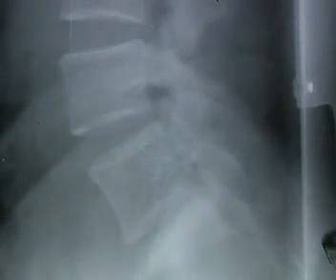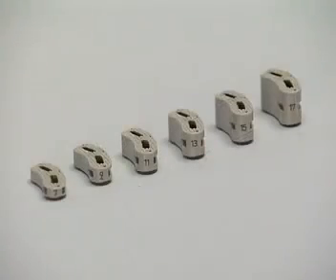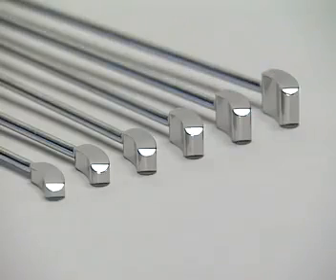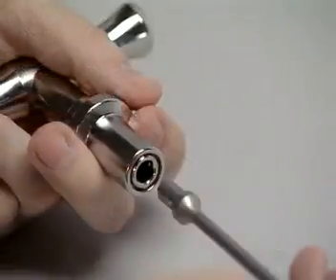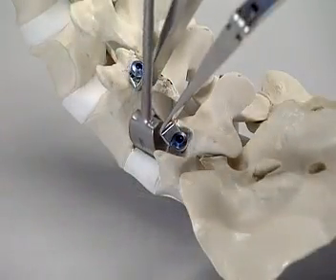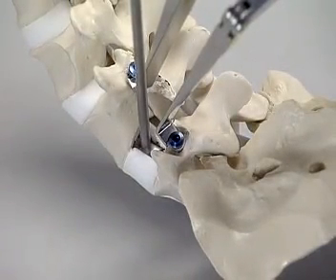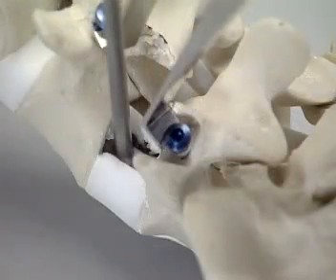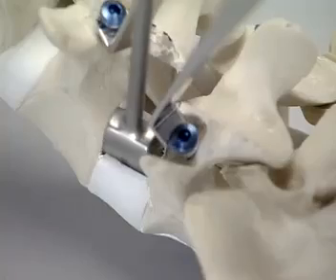Before surgery, the appropriate cage height is estimated by comparing the Travios radiographic template with the adjacent intervertebral discs on a lateral radiograph. The cage height is later confirmed by inserting the appropriate trial implant. The cage height ranges from 7 mm to 17 mm in 2 mm increments, and for each cage there is a corresponding trial implant. The trial implant is mounted on the T-handle by pulling back the sleeve. In this exercise, a 15 mm trial implant is inserted into the disc space to verify the cage size. With the segment fully distracted, the trial implant must fit tightly and precisely between the end plates. Using the largest possible cage maximizes segment stability by achieving tension in the longitudinal ligament and the annulus fibrosus.